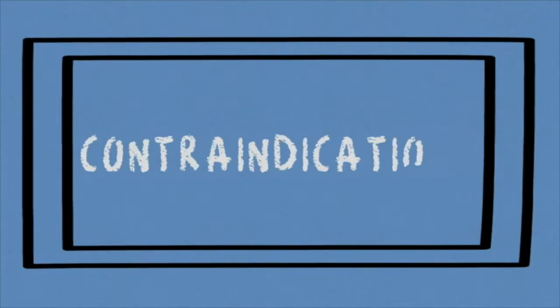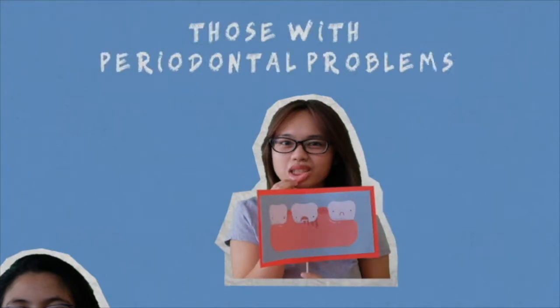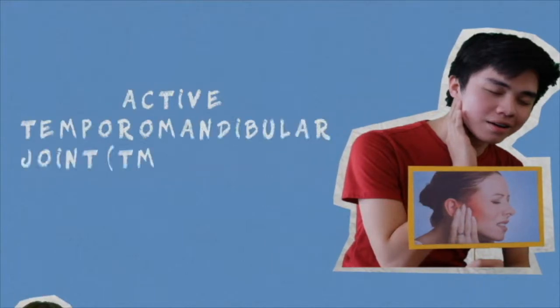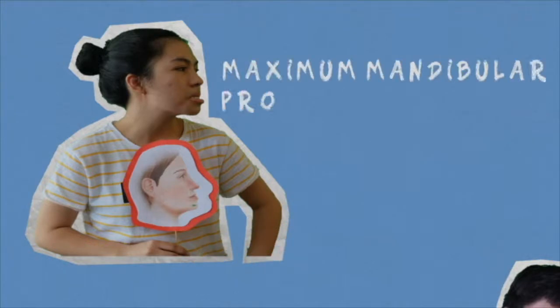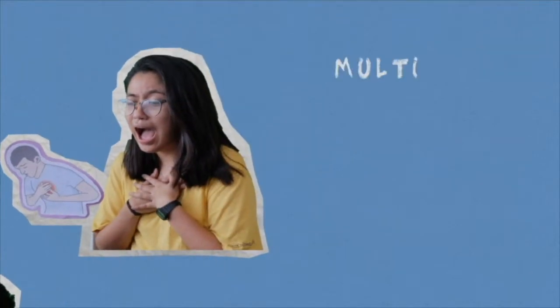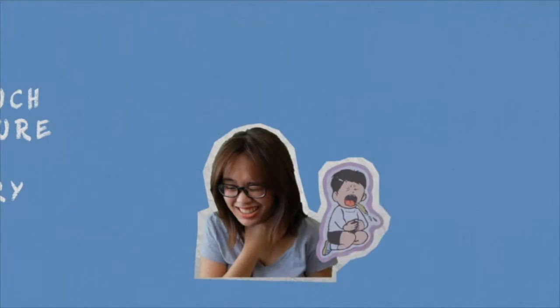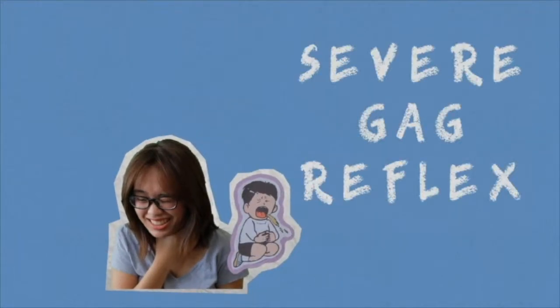These devices are contraindicated when there are insufficient teeth to support the oral appliance, periodontal problems, active temporomandibular joint disorder, maximum mandibular protrusion distance of less than 6 millimeters, and multiple comorbid conditions such as heart failure and respiratory failure, and even those with severe gag reflex.